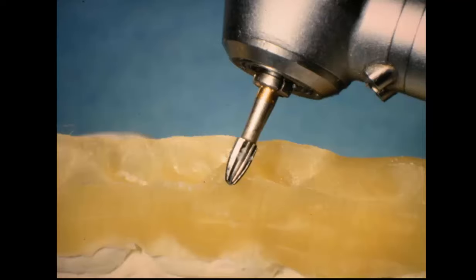Now, after this is cured with light, you can come in and trim off the little high spots, but leave the points where the teeth touch in here so that everything comes in contact at the same time.